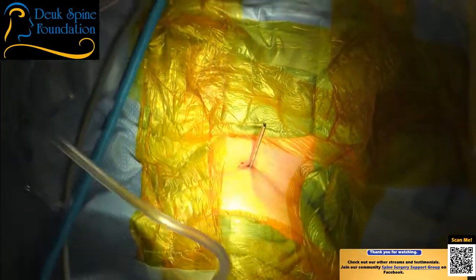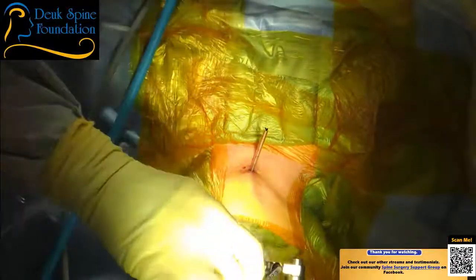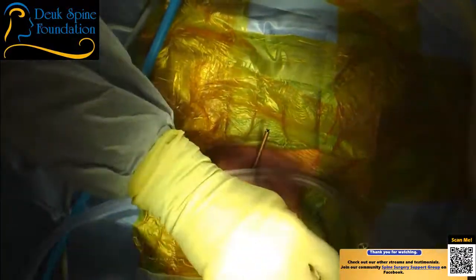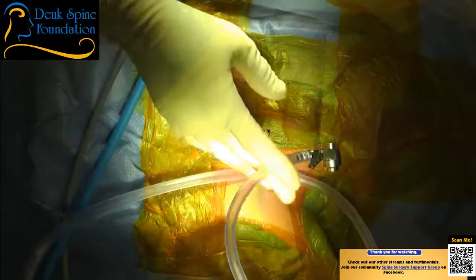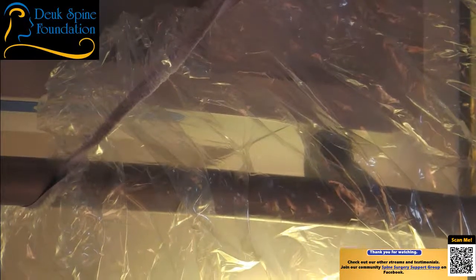Okay, you can relax. We're done. We are at 2, 3, 4, 5, 6. You can see the tube is to the back of the disc. Again, this is the Deuk laser disc repair. We're the first in the world to describe this procedure. And the primary thing we're doing is debriding the annular tear and removing any herniated fragments we encounter.